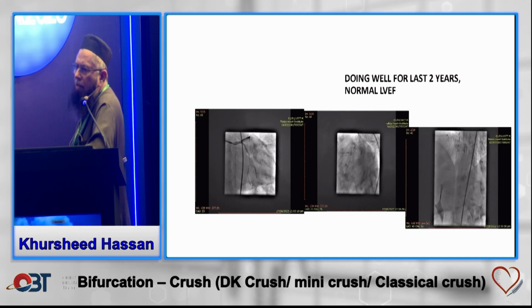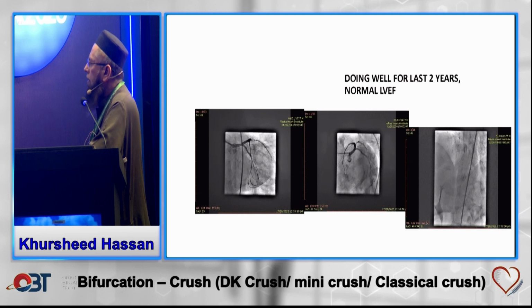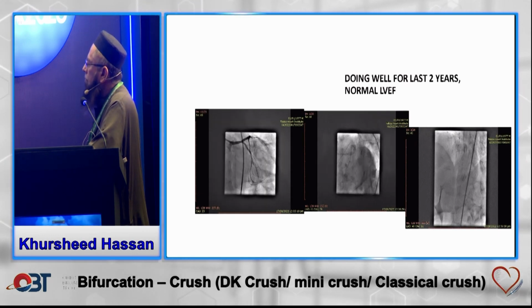Unfortunately, I did not have IVUS in this lab in which I was doing this. Preferably, whenever I'm doing a DK crush on the left main, I prefer to do IVUS.